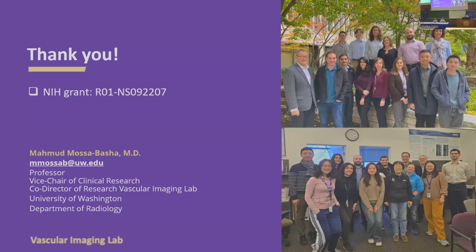In the literature, eccentric has 5 different meanings, whether it's greater than 50%, whether it's concentric, whether it's 100%, whether the thickest is not thicker than twice the thinnest. So there's a lot of definitions out there, and the goal of this is just to standardize and threshold and create a single model that we can use to differentiate diseases.